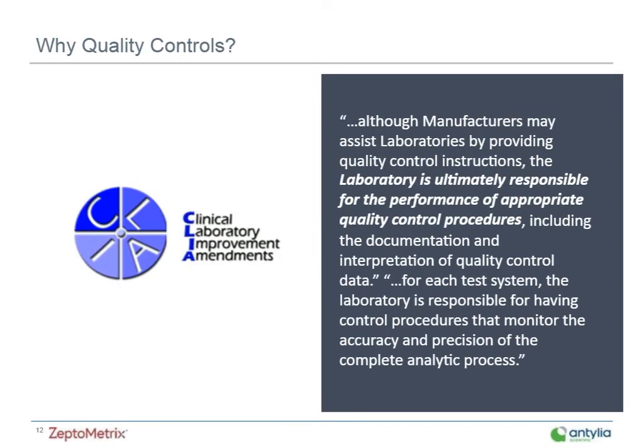So why quality controls? The CLIA program, I'm sure you're well aware if you're in a clinical laboratory, regulates laboratories that test human specimens and ensures that they give accurate, reliable, timely patient test results. Labs can obviously obtain CLIA certificates depending on the kind of diagnostic tests they perform. And CLIA states specifically that the laboratory is ultimately responsible for the performance of appropriate quality control procedures, really putting the onus on the laboratory to set up their own quality management systems.